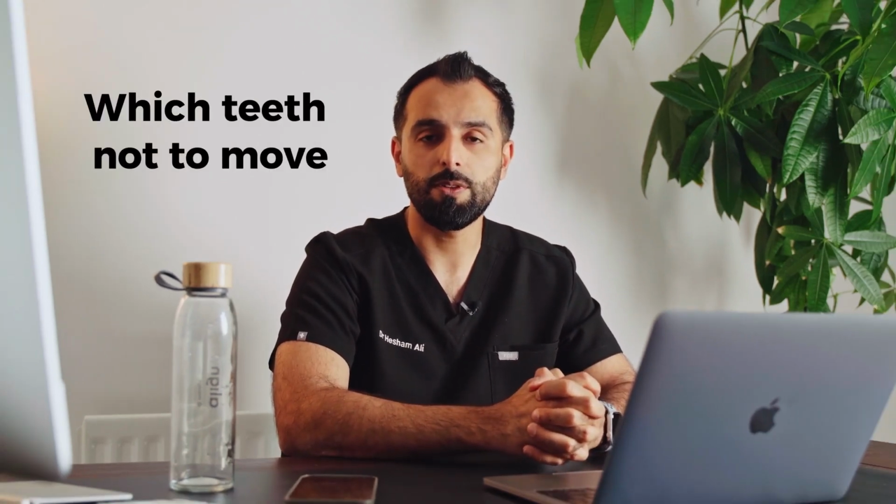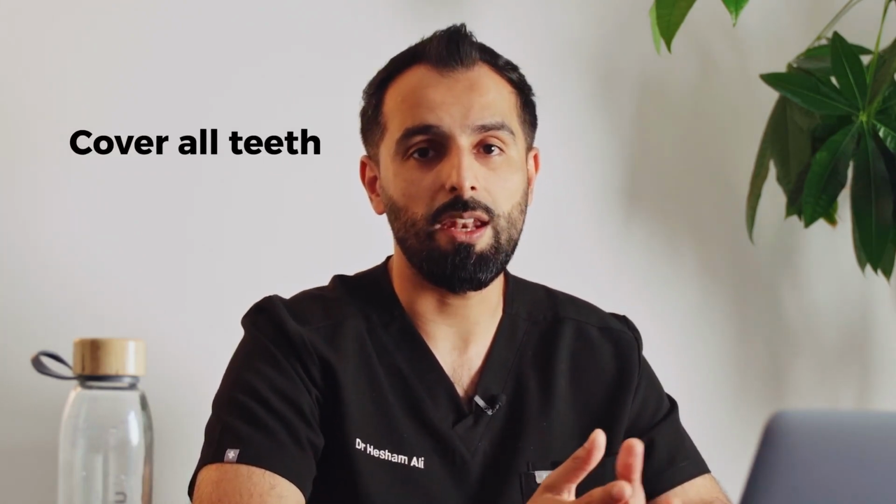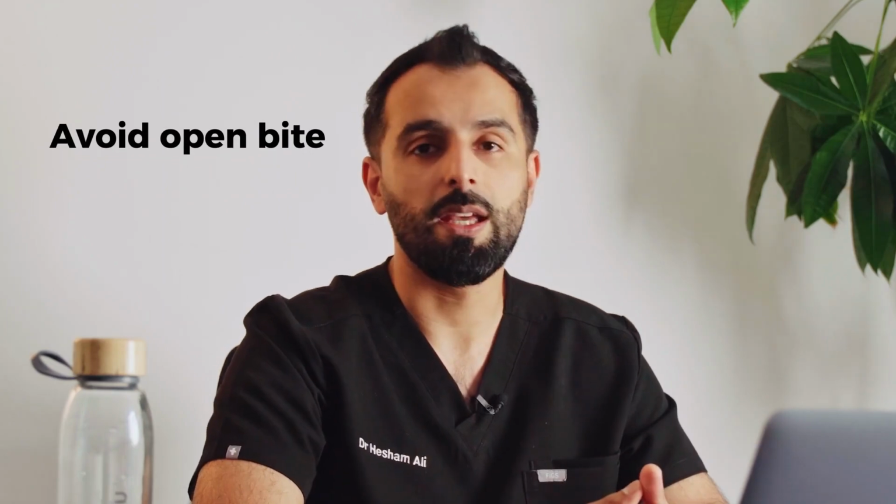So we need to identify very clearly for our technicians which teeth not to move. We also should identify for the technician that the teeth should still be covered by the aligner, as otherwise you'll get some eruption of these teeth and it could lead to an open bite developing later on down the line. So that's the first thing, is identify which teeth you don't want to move.